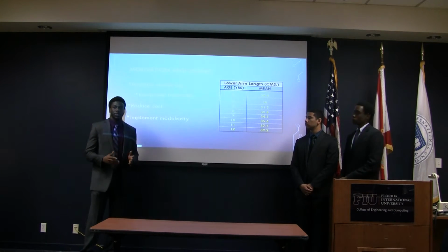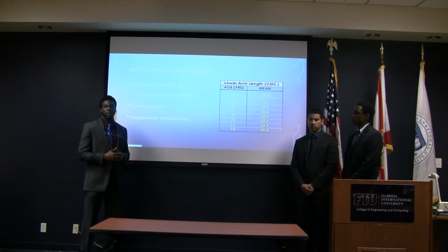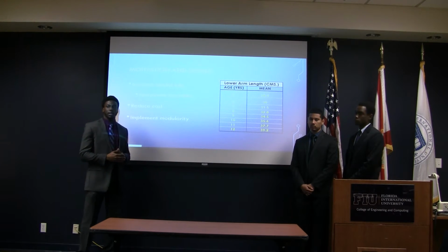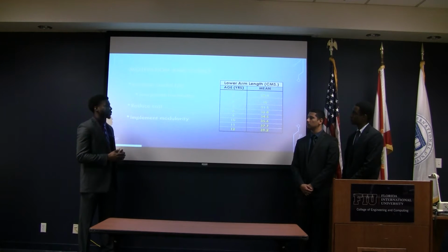Now, on to our motivation and goals. Prosthetics in general are extremely expensive, especially considering that our prosthetic is geared towards children who are at a time in their lives where they're constantly experiencing growth. This makes it extremely difficult for their parents who want their child to have a functional prosthetic, but won't be able to financially compensate for the constant replacement of the prosthetic to accommodate their child's growth.